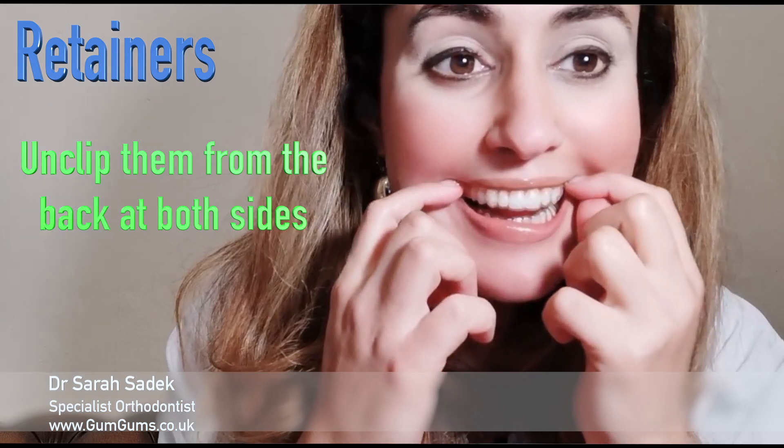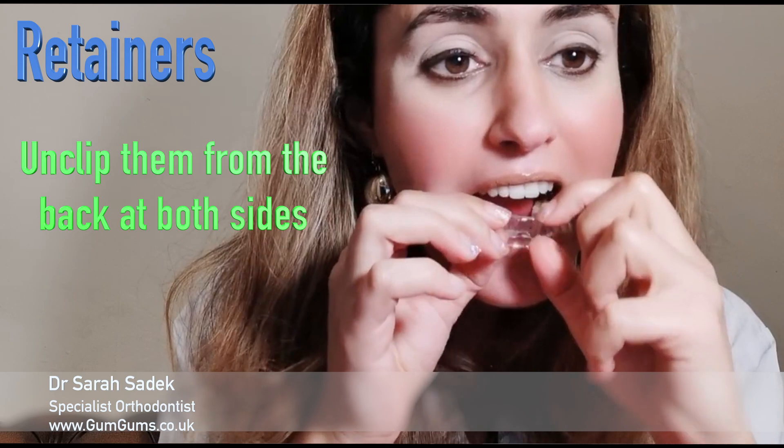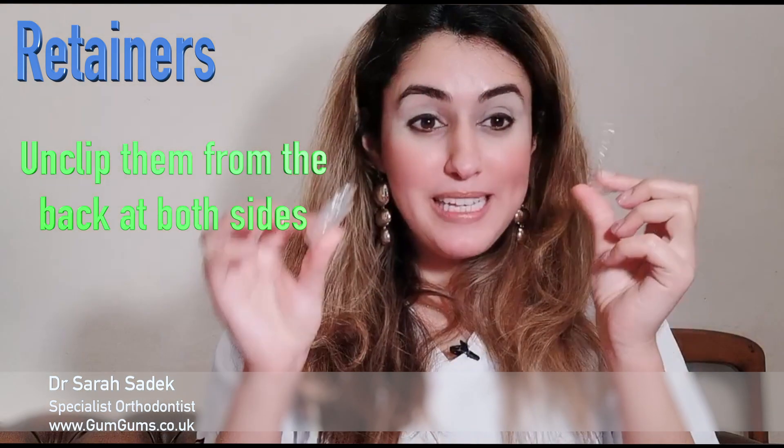I'm now going to show you how you take the retainers out. To take the retainers out, you put your fingers in at the back of your mouth and pull the retainer down from the back initially, and then ease it round at the front.